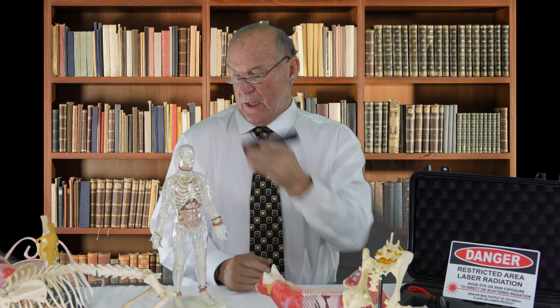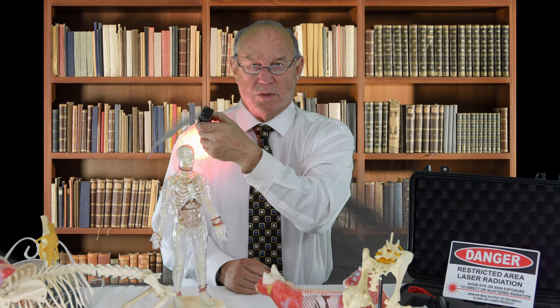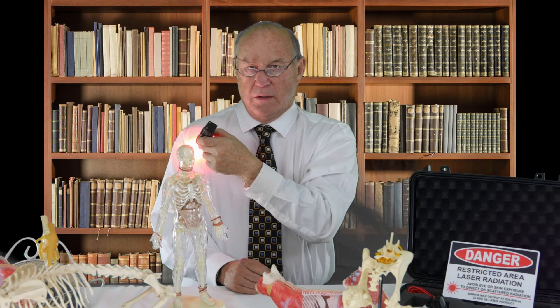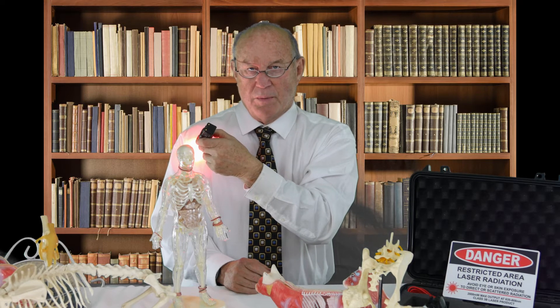It's as simple as holding it up and lasering for about 60 seconds, then switching to the next one. The sequence is: pain spinal, pain joint, fracture nonunion, and then bicipital bursitis — and you're done.